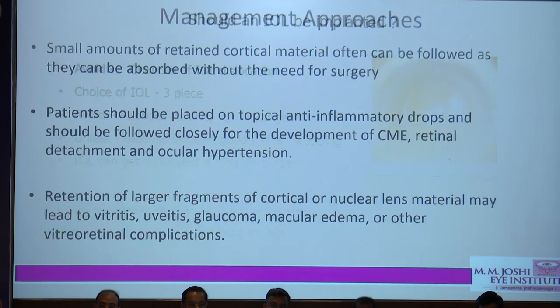Management approach: small amounts of retained cortex often can be managed. Now, how small is small is the question which always comes to our thought. The patient should always be placed on anti-inflammatory drops and followed up closely. Retention of a larger fragment of cortical or nucleus matter may lead to vitritis, uveitis, glaucoma, macular edema, and definitely vitreoretinal complications. So I'll be just showing how we do it from the VR perspective.